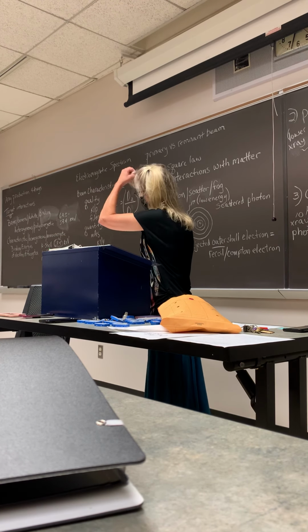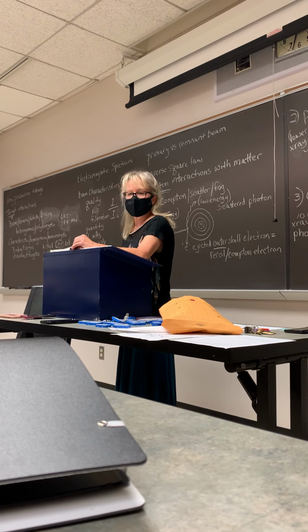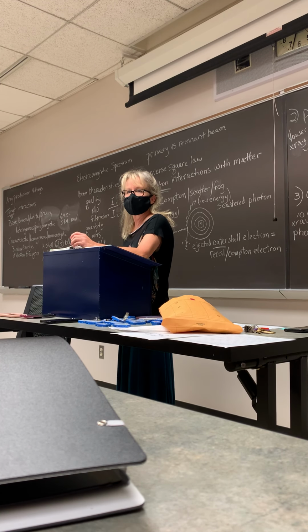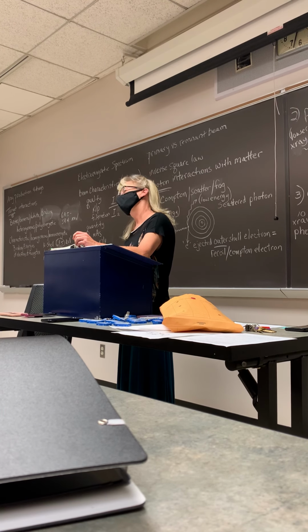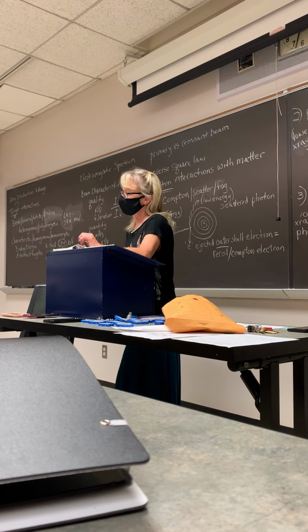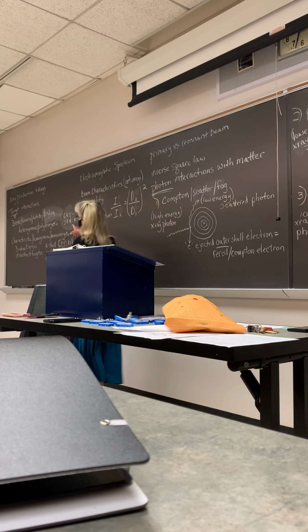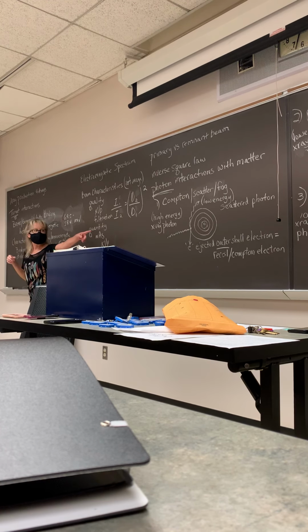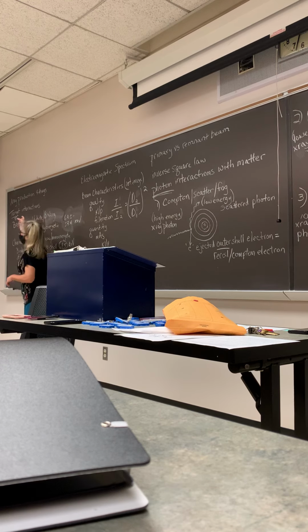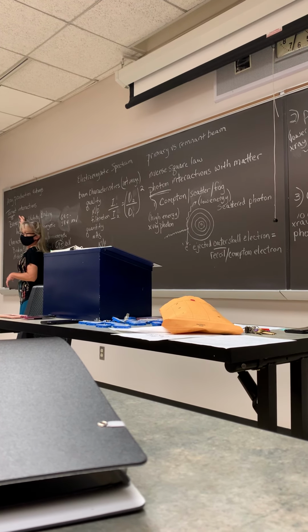Okay, so starting out with X-ray production, 4 things needed. What's the first thing that's needed to produce an X-ray? Good, electrons. So we need electrons. I'm talking about in the target, in the tube itself. I'm not talking about these, which I'll get to in a minute. We're talking here about everything that happens inside the X-ray tube, okay?